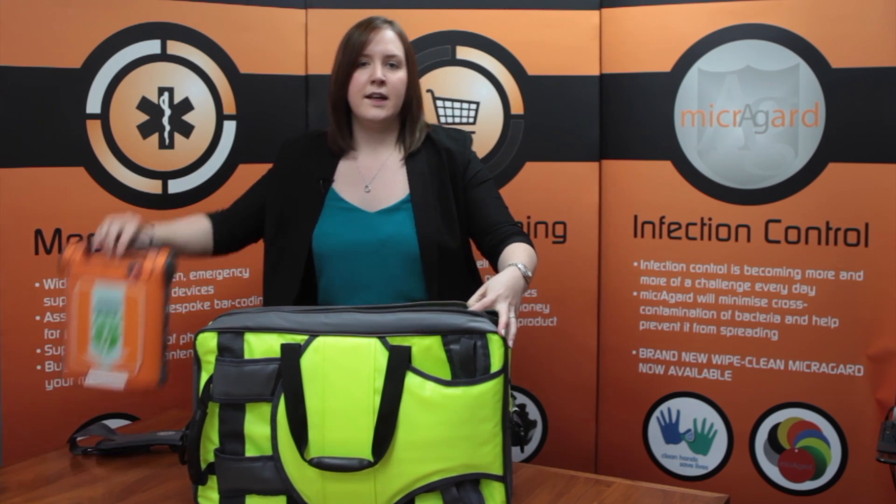The rear section of the bag is a large zip pocket with foam protection, perfect for holding most standard AED units or many combinations of our open house pouches.